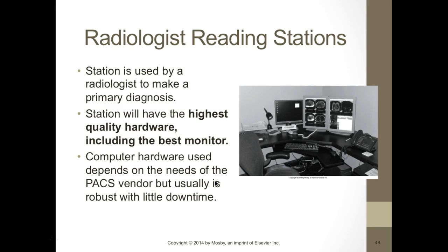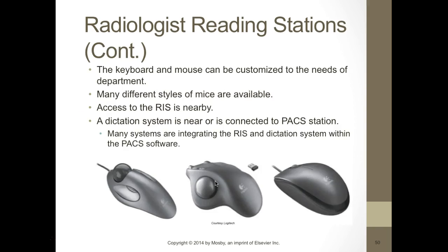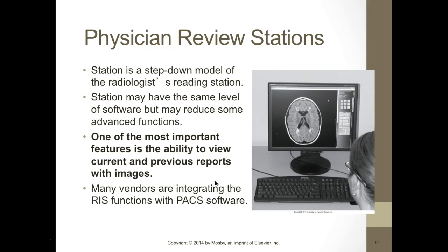So computer hardware used depends on the needs of the PACS vendor, but usually robust with little downtime. So the keyboard and the mouse can be customized to the needs of the department. So there's many different types. That's about all you need to know with that.